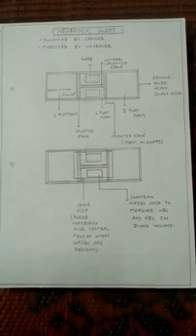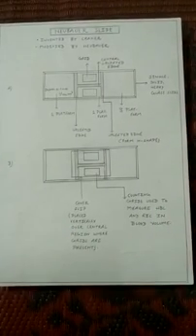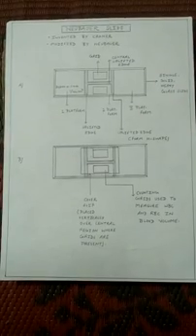Hello friends, welcome again. Today we will discuss the Neubauer slide and why we use a Neubauer slide. So friends, we know that human blood is composed of RBCs, WBCs, platelets and blood plasma. To count the number of WBCs and RBCs in our blood, we use a special type of slide which is known as the Neubauer slide.